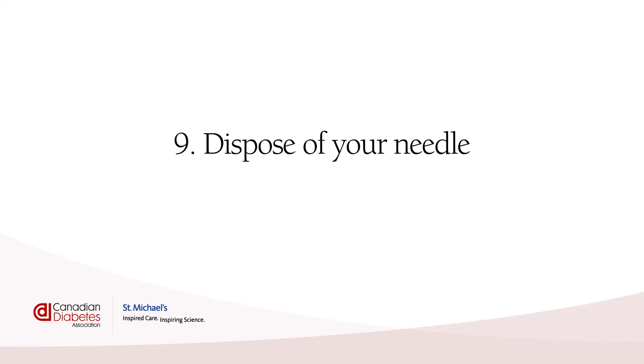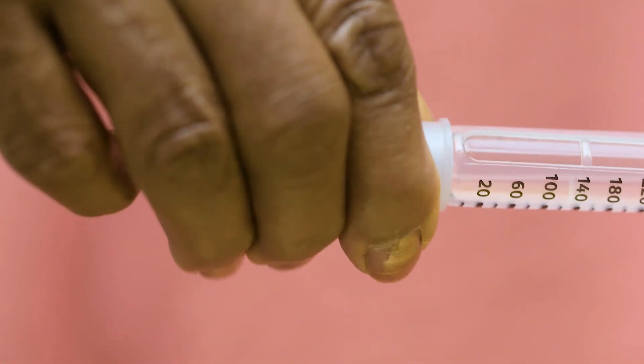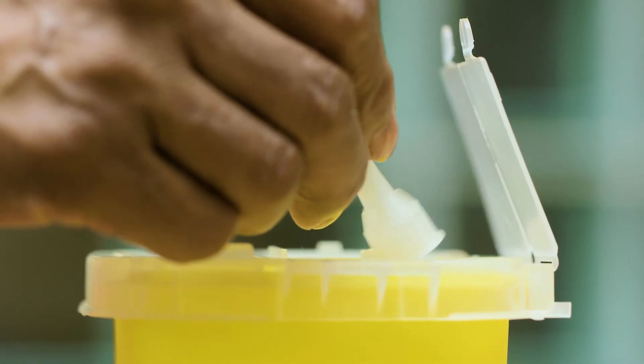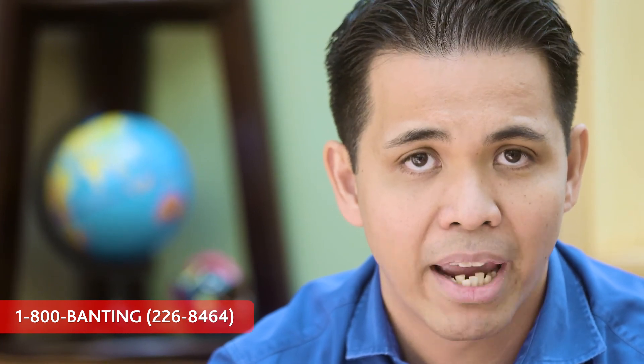Dispose of your needle. Your needle should only be used once, so after each injection you should get rid of it safely. Just use the needle cap to help remove the needle from the pen, then put the pen cap back on. You'll need to put your used needles into a container made from hard plastic. Your local pharmacy can give you a special sharps container, and some public washrooms have them too. When your sharps container is full, you can drop it off at your pharmacy — it should not go into regular recycling or garbage. If you have any issues getting a sharps container or dropping it off, you can always ask someone on your diabetes team or call 1-800-BANTING.